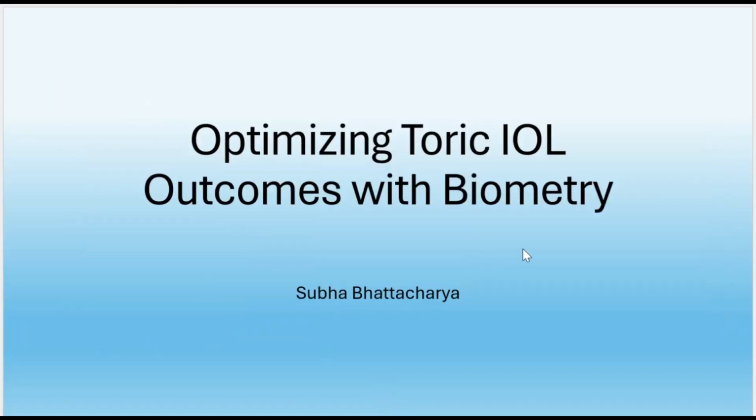Friends, today I'm going to talk about how to provide the right outcomes with your toric IOL to your patients, with respect to the biometry, right? So, how could you do a great biometry to provide the right outcomes with toric IOLs to your patients?